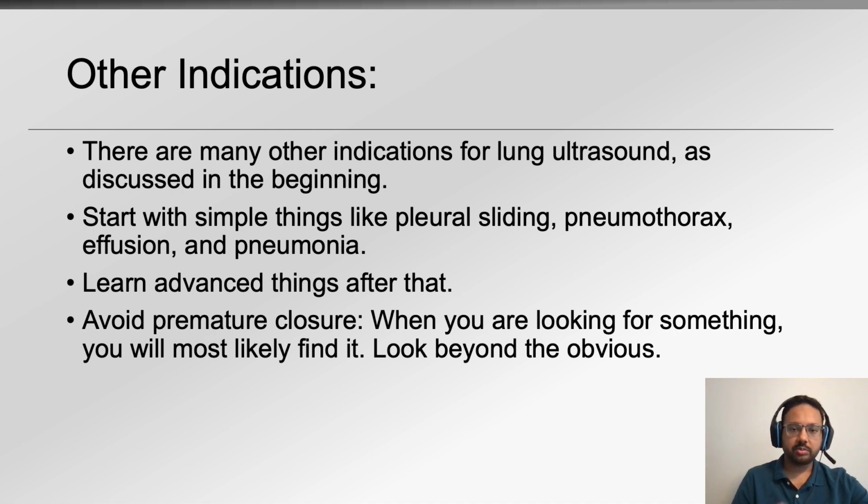I want to close this presentation with my advice about premature closure. A lot of times when I started doing ultrasound early, I was a hammer looking for a nail. What that means is I went into the ultrasound exam thinking in my head that this is what I'm going to find, and that's exactly what happened. I found whatever I was looking for. But that led me to make errors, and I want you all to avoid that by looking beyond the obvious and avoiding premature closure. So that'd be my advice as you learn more and more point of care ultrasound.